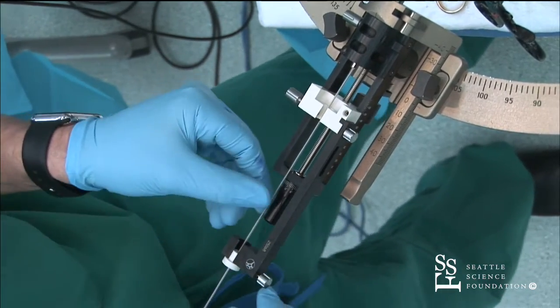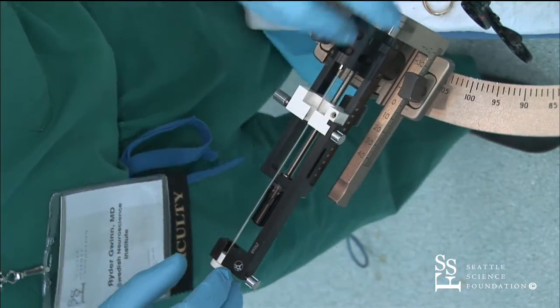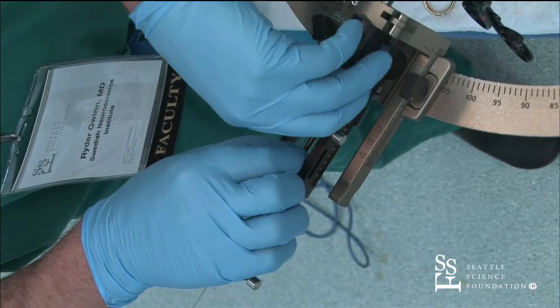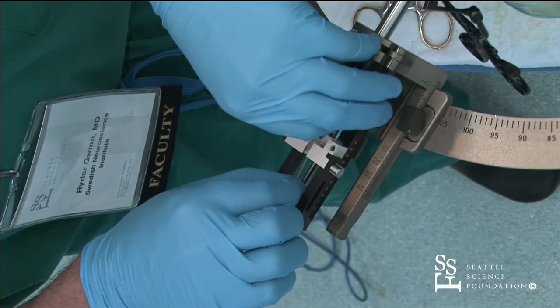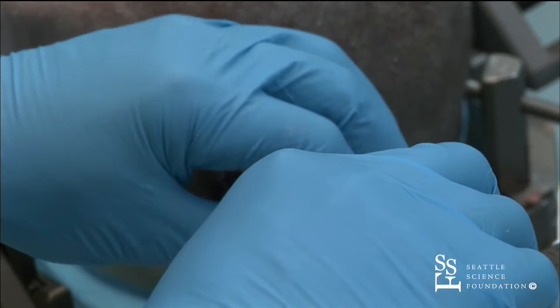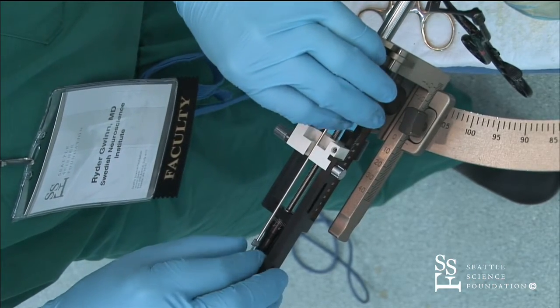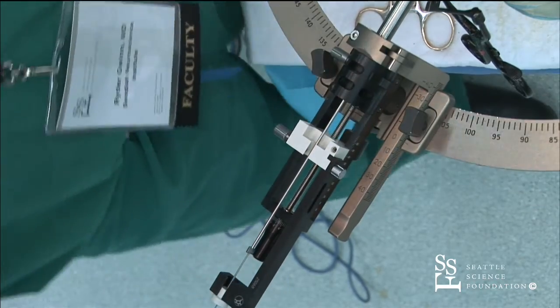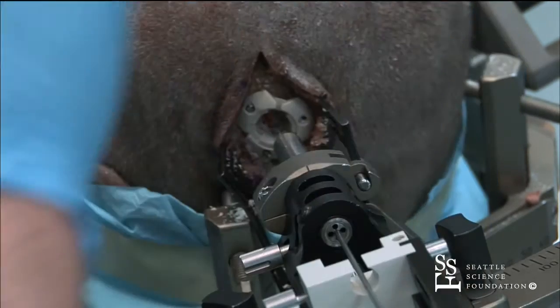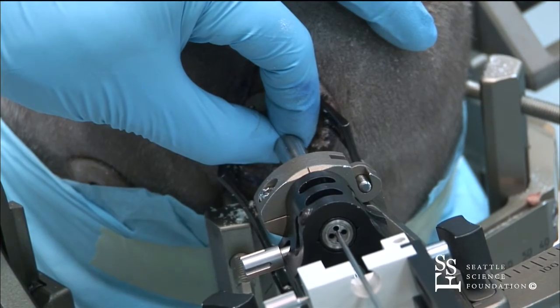Okay. And then basically, you can deploy the electrode. It's better to have two people and have one person slide up the cannula. And then I typically will mark the electrode at the level where it leaves the burr hole cover to make sure that if it moves at all, I'll recognize that. So just mark it right here. And then typically have somebody hold this while we deconstruct.